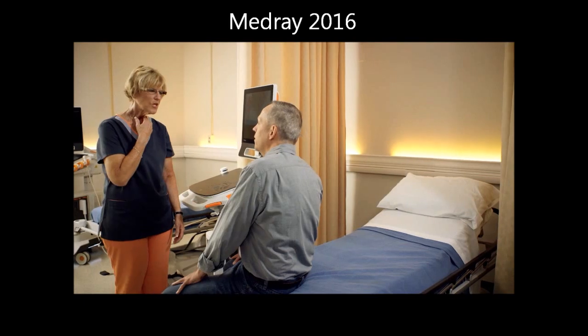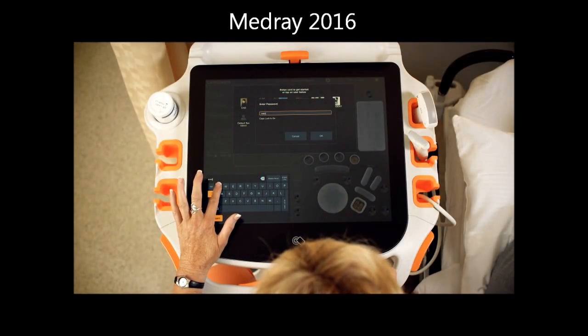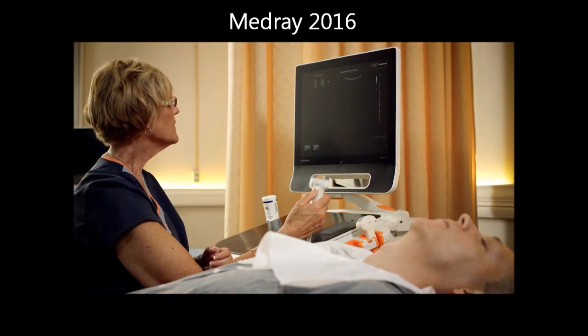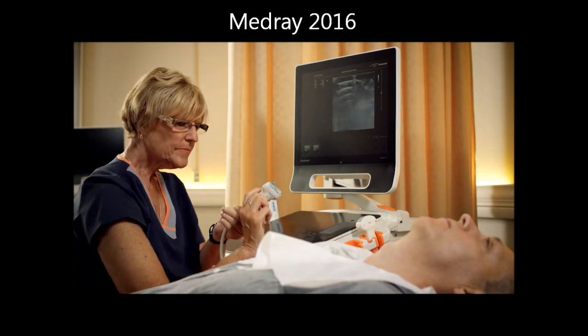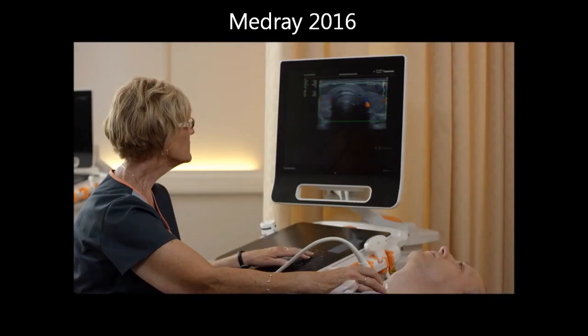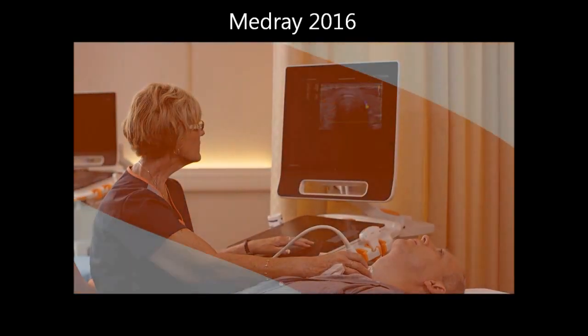Since TouchPrime adapts to you, productivity naturally improves, along with patient care and satisfaction. You deserve a better way to work, with a system that adapts to how you want and need to work. The CareStream TouchPrime makes it possible with an intuitive, powerful, and streamlined user experience built around you.